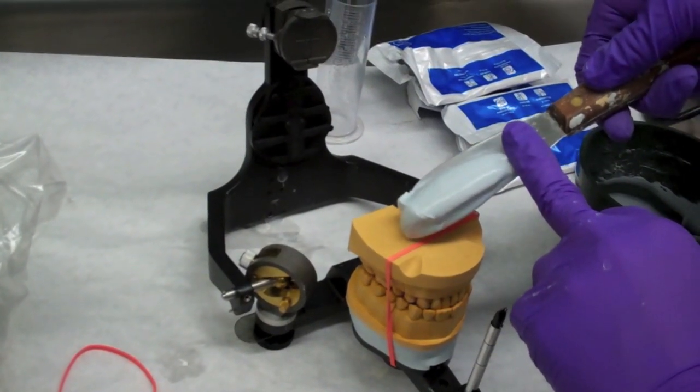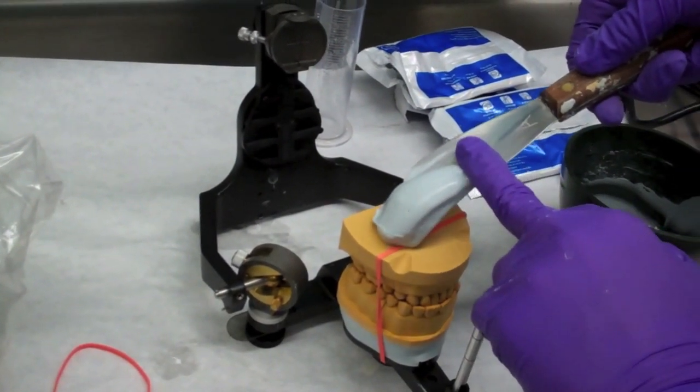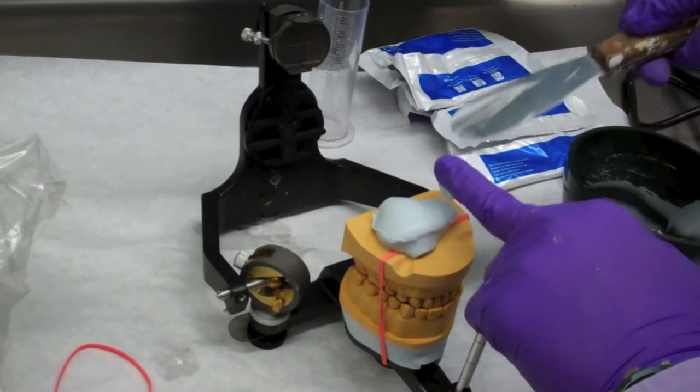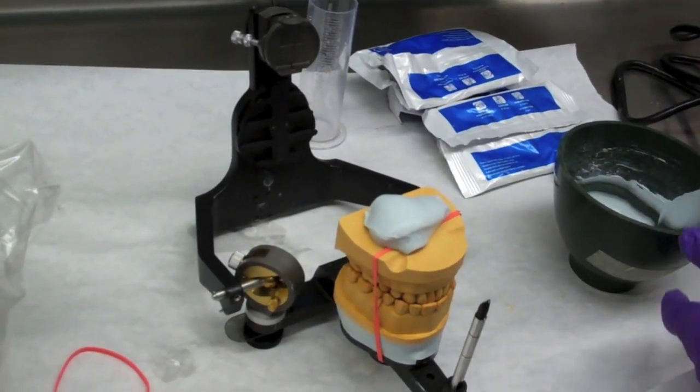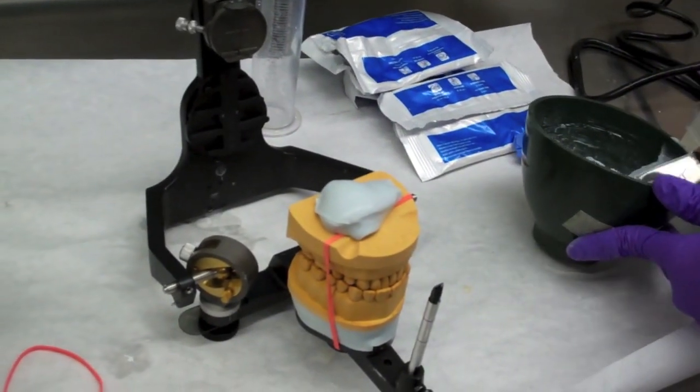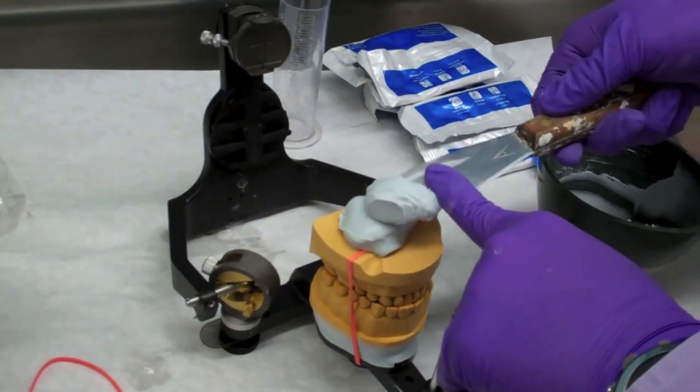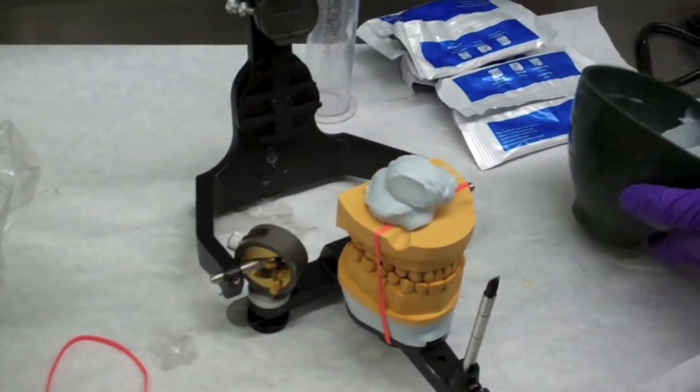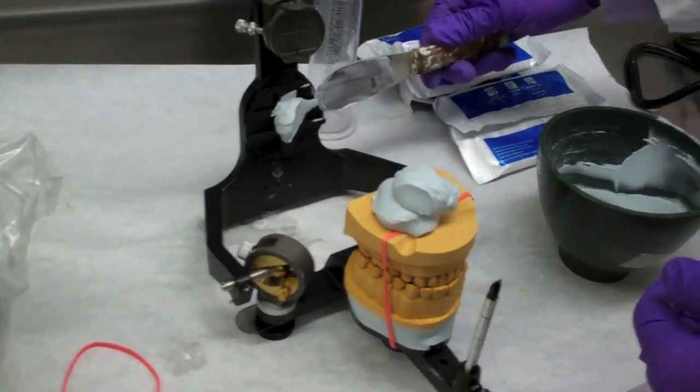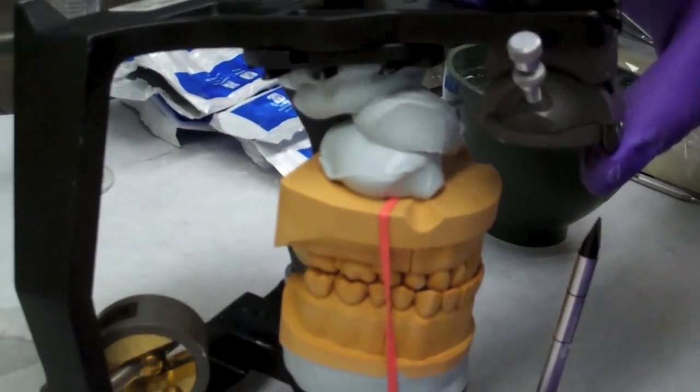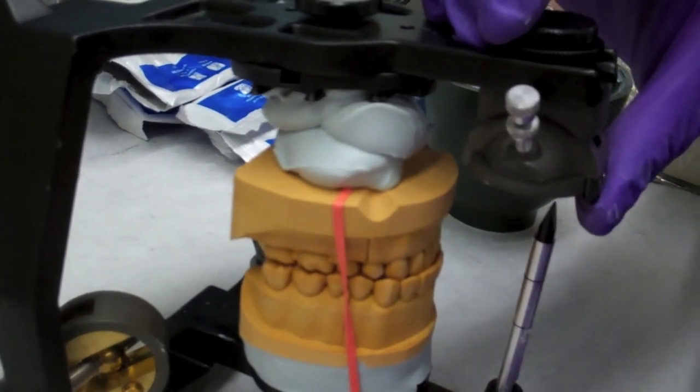With the articulator upside down, we will now repeat the step of mixing another batch of stone. The same steps done to the maxillary will now be done to the mandibular. You will mix another batch of stone, place it in the center of the model, and on the articulating plate. You will then close the articulator as you did with the maxillary cast.